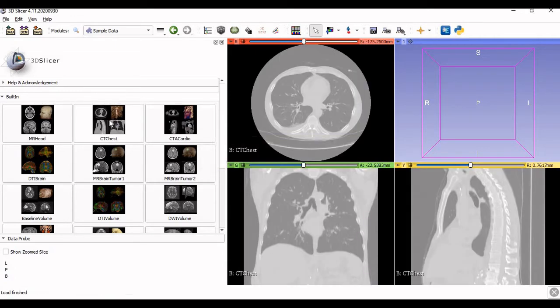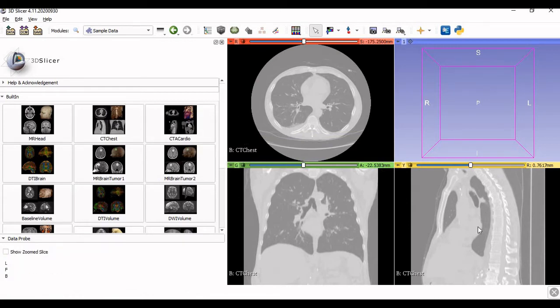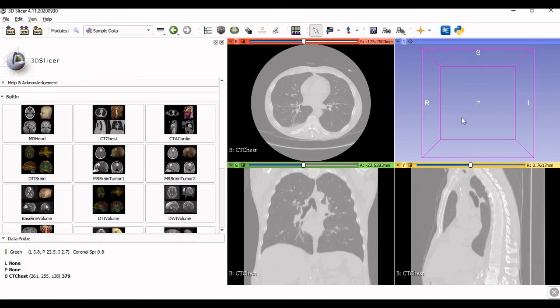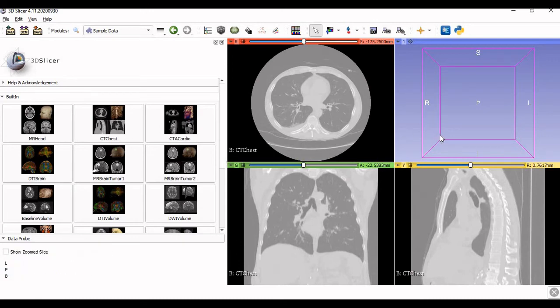Once you click on it, it will take some time to upload those images and they will be visible on the right side of the screen. After this, the task is to segment the images such that the required body part is generated and you are able to see the 3D model of it. Once you have uploaded the data, the next step is to go to segmentation.